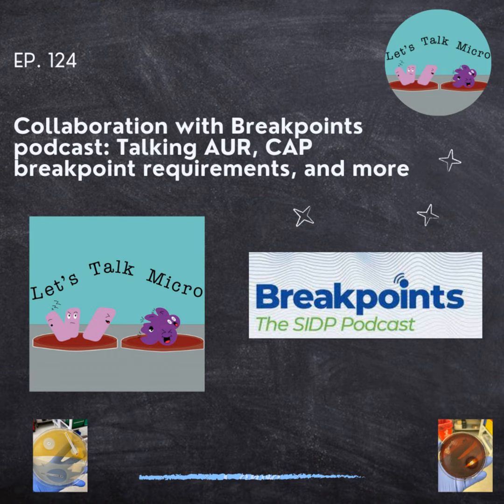And a lot of it probably has to do with the fact that you're having to validate with 30 organisms, or depending on, you guys have a bigger hospital, so you guys are able to do more there. But for some of our smaller community hospitals, validating 30 organisms is a feat when you have one senior tech working a day.